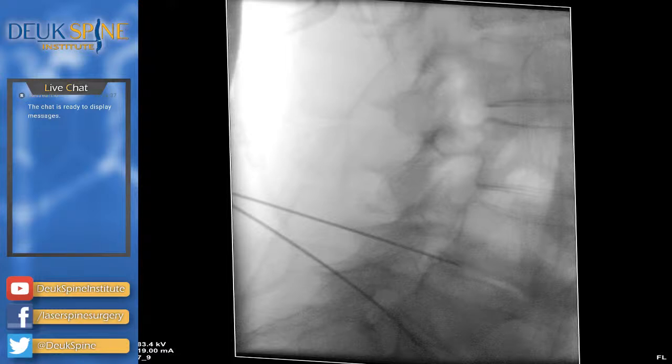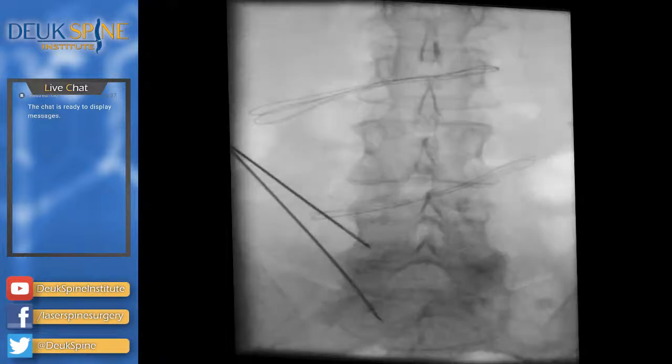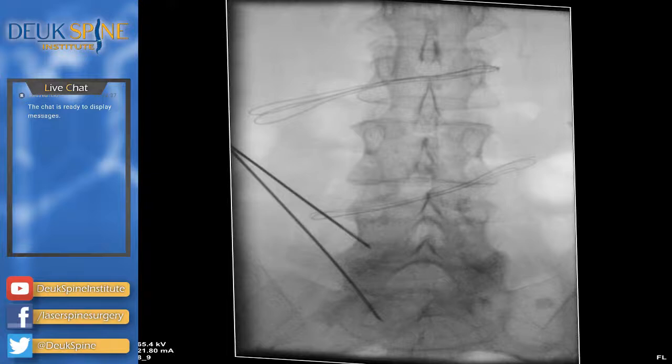You're doing good, okay? Everything's fine. I promise. The only reason it's taking me a little longer than normal is these two discs are just so collapsed. But I know they're still causing you pain, so I want to make sure we get them. All right, lateral. That's all looking good. 3-4 will be a lot easier to do.